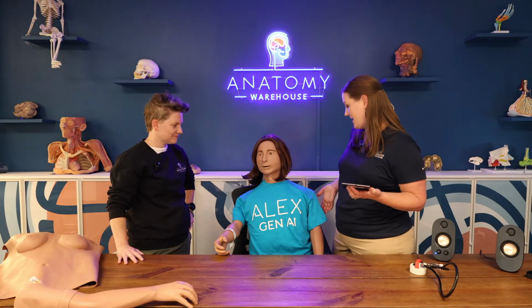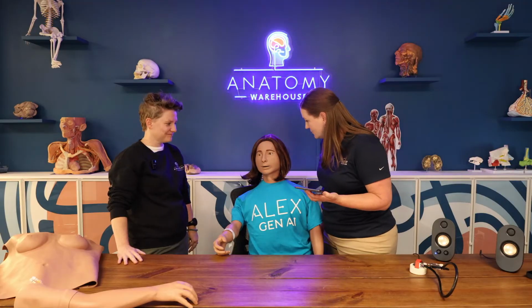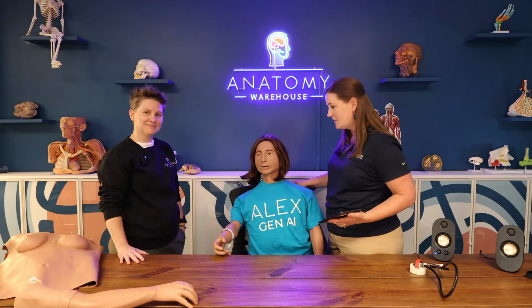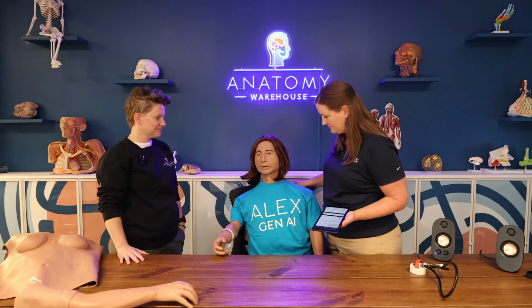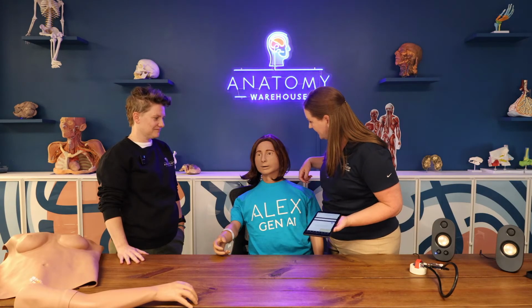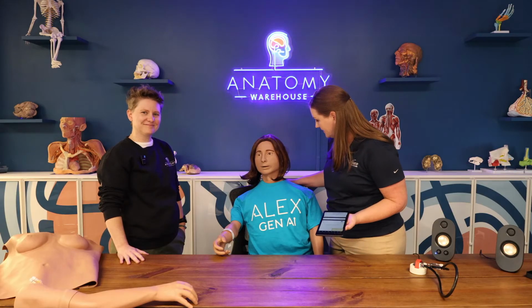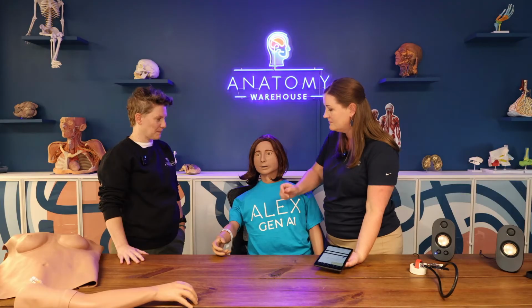So let's have a chat with Vivian. Let's get her ready. Good afternoon. What's your name? Good afternoon. My name is Vivian Lopez. Well, nice to meet you, Vivian. Nice to meet you too. My name is Melissa, and I'm your practitioner today. Great. Thank you. What brings you into the clinic? I'm here to establish primary care.